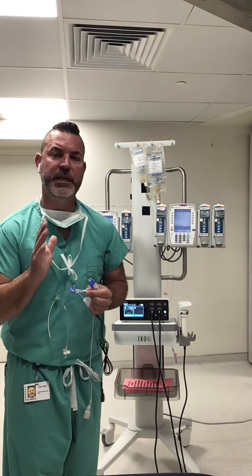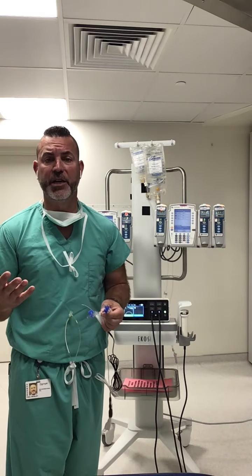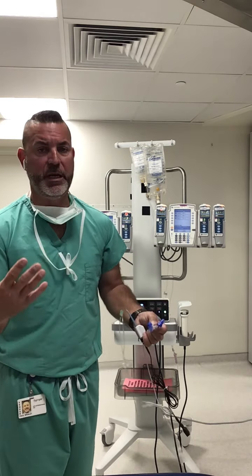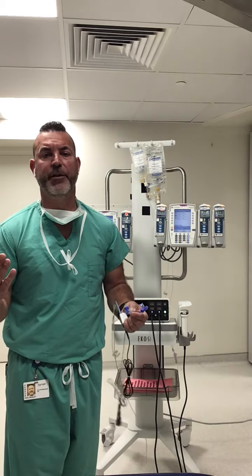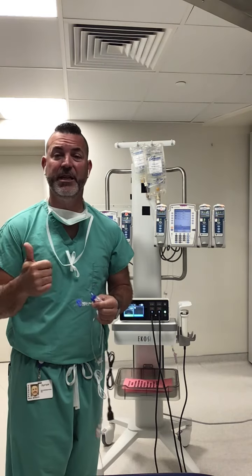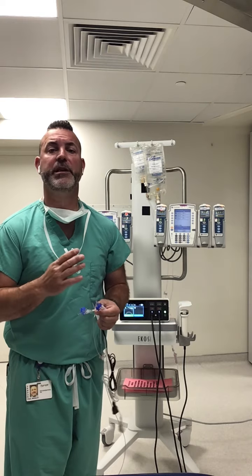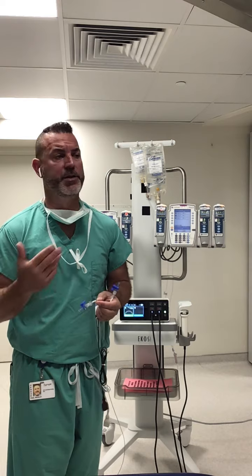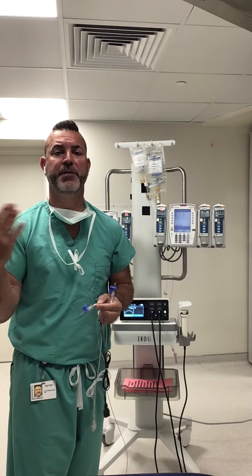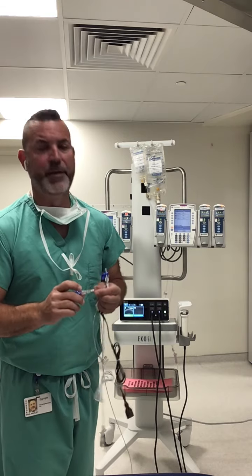I just want to give you an example range so you have an idea of our milligrams per hour. How long are we treating our patients for? On average, we can treat PE patients as little as 2 hours, which is really great. But on average, I see our patients at 6 to 12 hours for PE, DVT and arterial. The treatment time, again, same 1 milligram per hour, but we're going to be treating them overnight. So if they place it in at, say, 4 o'clock or 2 o'clock in the afternoon, we're going to see those patients in the ICU overnight, and they're going to go back down to the lab in the morning for a recheck.